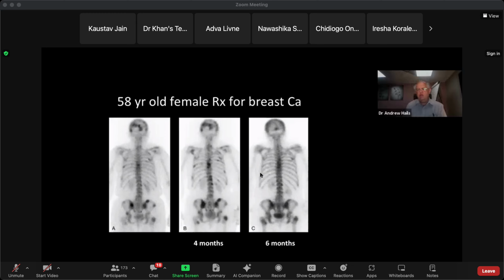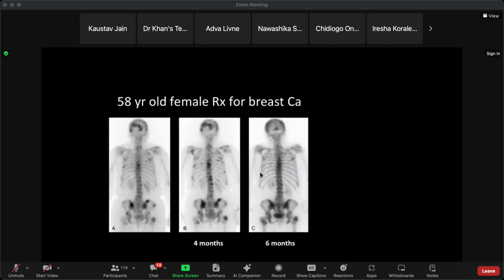Okay, so just to clarify, in between the first image and the second image, was the patient getting worse, having progressive disease, stable disease, or do you think they were improving? So if the patient was having treatment at that time, in the early phase of treatment, it's actually quite difficult to characterize if it's the disease which has progressed or if it's just response to immediate treatment. That's my understanding, but I could be wrong there.